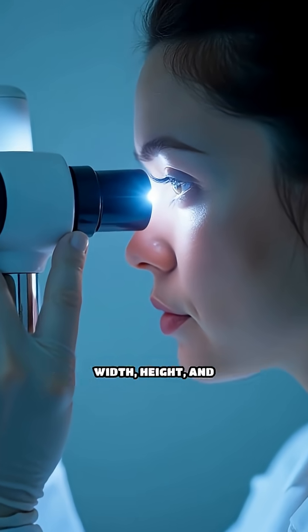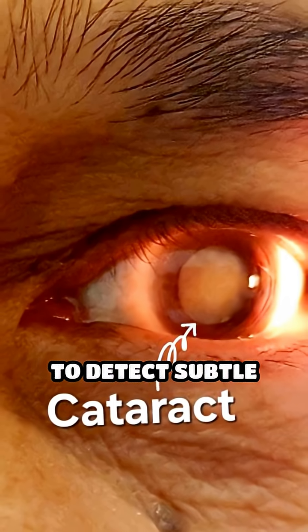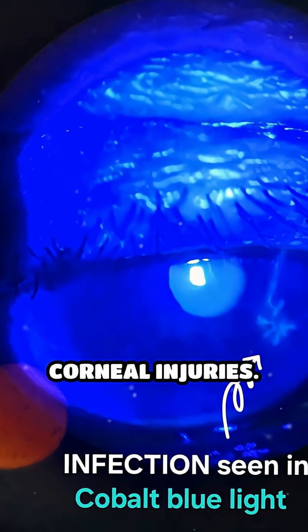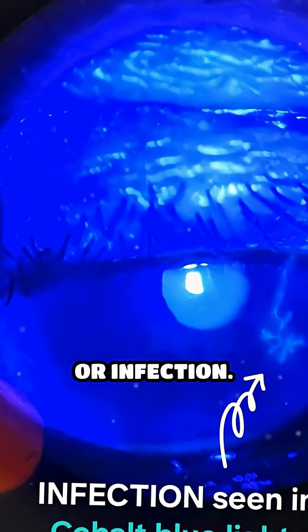By adjusting the width, height, and angle of the light beam, we are able to detect subtle abnormalities like cataracts, corneal injuries, inflammation, or infection.